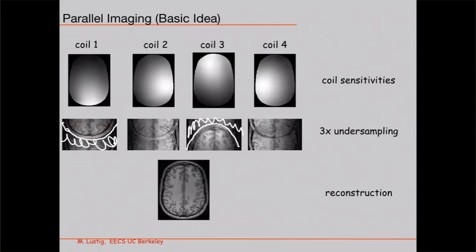There's still stuff, right? But every time I've got 3 foldings, weighted differently. So effectively, I have 3 unknowns here, and 3 unknowns here, and 3 unknowns here. It's the same 3 unknowns, but I have 4 equations for them. So I have 4 equations and 3 unknowns.